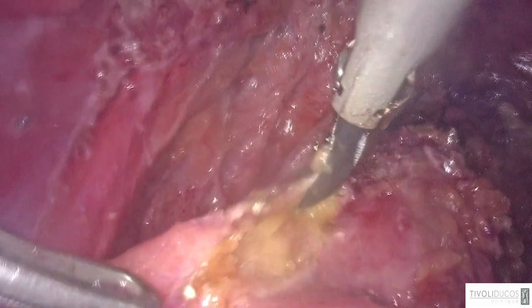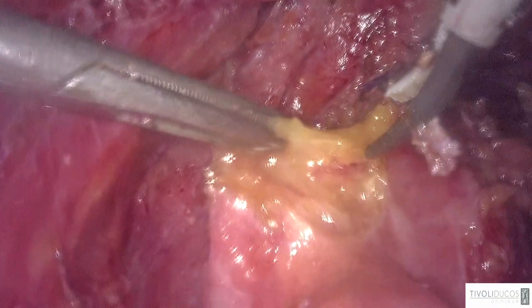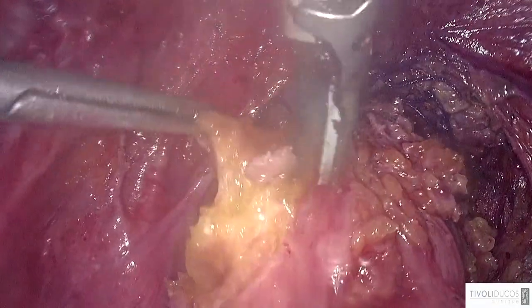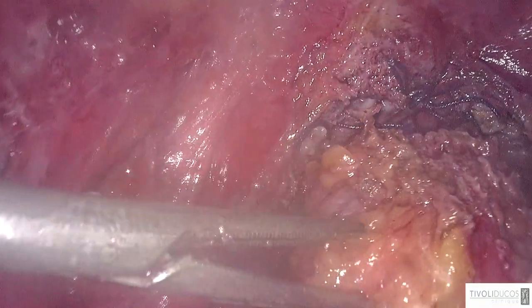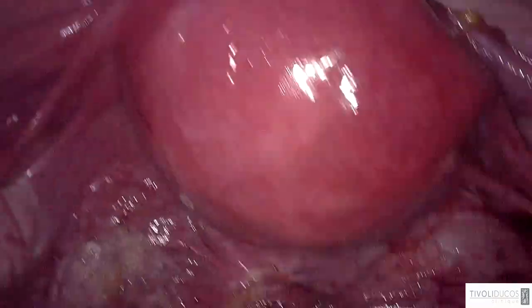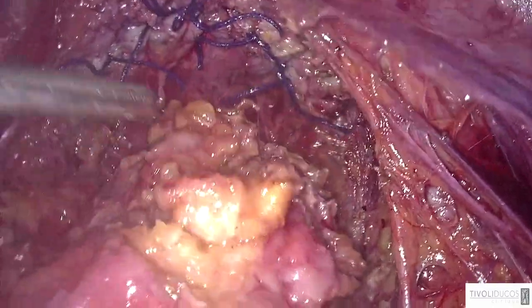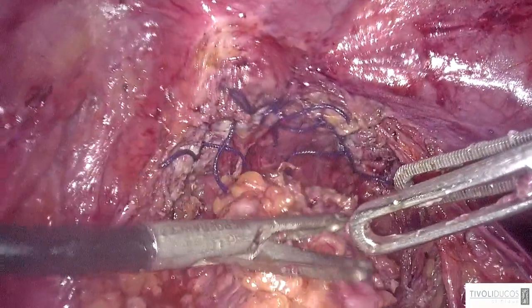Okay. Horace, yes. Hear me? Yes, I hear you. At this moment, is there any probe or not? Is there anything in the rectum now? Yes, yes. I put the rectal probe. I showed you previously. It is a disposable rectal probe. But you can put anything you want. But you have to feel very well the rectum. So here, and you have to see the thickness. You see, it is obvious that the rectum is thickened here, because the rectal probe is here, and this thickness is completely abnormal.